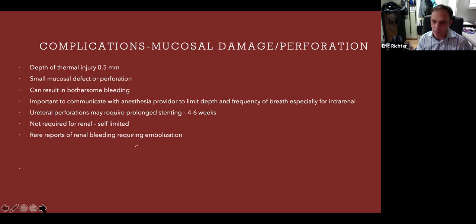But when you're lasering in the kidney, if the patient is taking deep breaths, those big movements can be very dramatic in what you see on the screen. So it's important, sometimes it depends on the anesthetist. I'll always tell the anesthetist if the patient's moving around too much that they need to get the breaths under control, because otherwise there's too much movement.